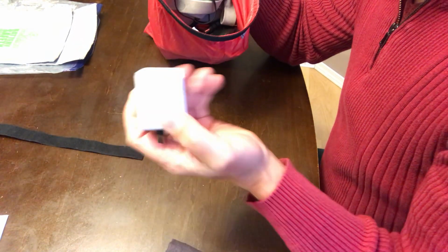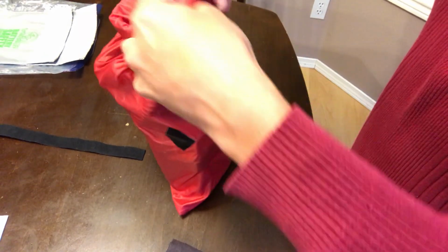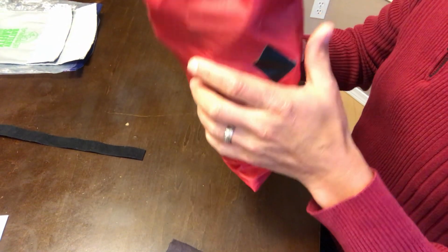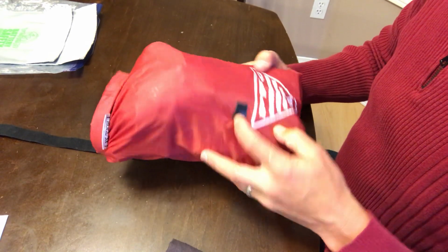You have your earplugs, your mask, and I would leave the connector out with my USB to charge my phone at various places along the way, and the alcohol I use for other things as well, so I left that in my toiletries kit. But that's everything for this kit. And I just fold it up, press it down, and then voila. I did spring a hole in there, so I had to, a couple times, so I had to tape that up. But anyway, everything's in there.